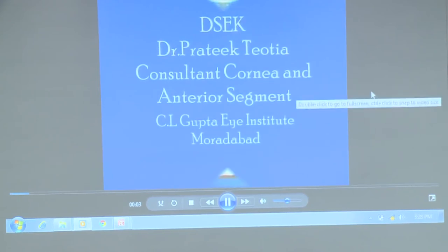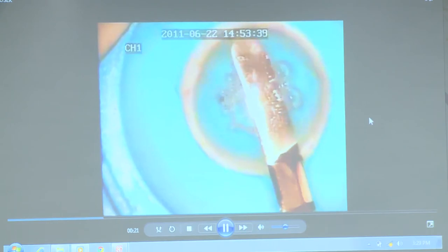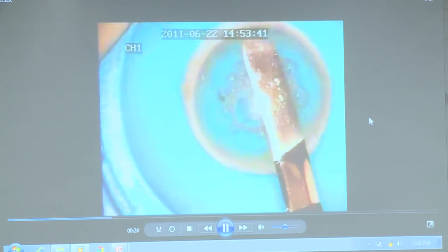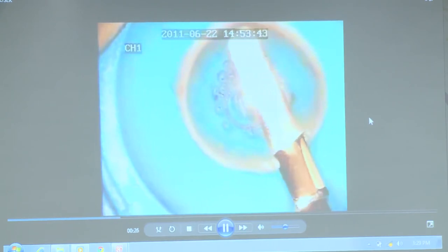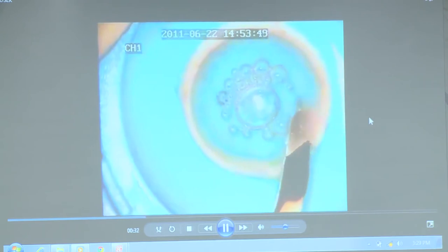The donor corneoscleral rim is mounted on an artificial anterior chamber, and you can scrape off the epithelium. Then dissection is carried out with blunt dissectors. I usually use the dissectors provided by Indo-German. They are of two kinds, one straight and another slightly curved.